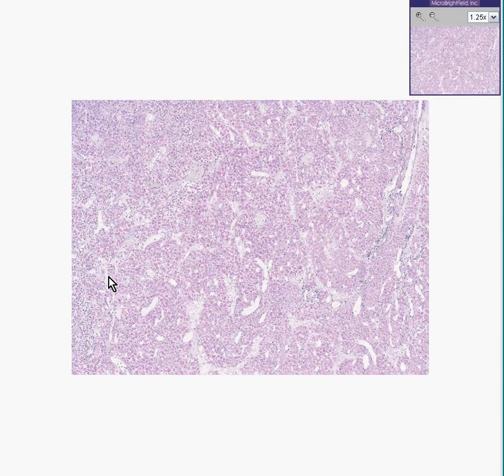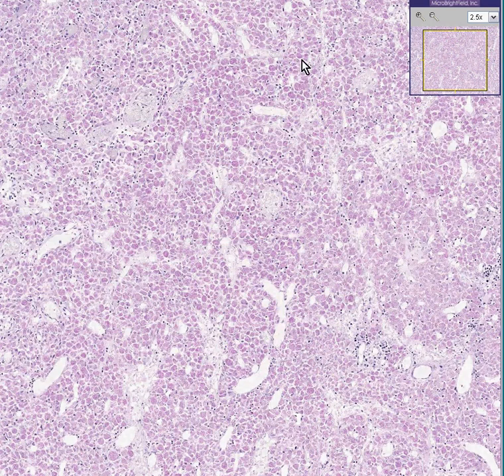If I told you this was a lymph node once again, I'm sure you wouldn't believe me, because you would say lymph nodes are supposed to be blue and show lymphocytes and look lymphoid, but this doesn't. Well, first of all, this is not even an H&E stain.